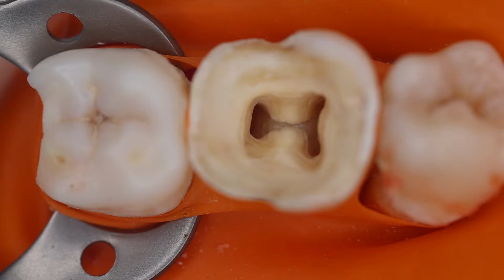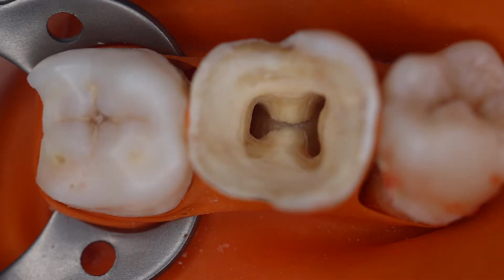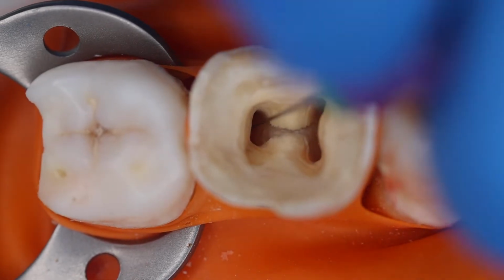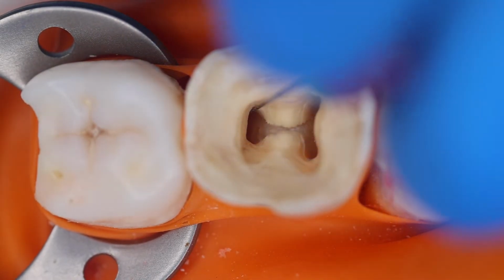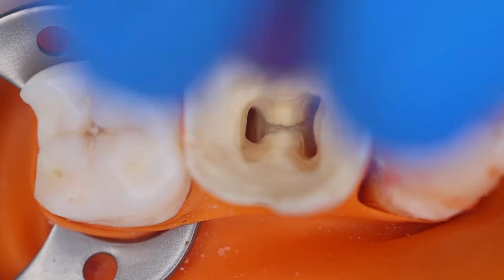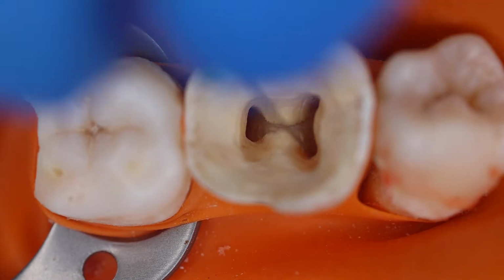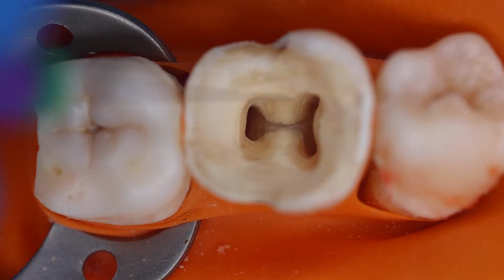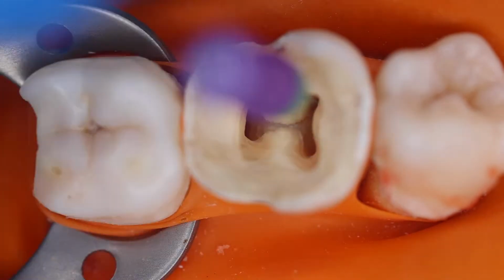In this video we are going to demonstrate how to use the electronic apex locator to determine the working length. Once we have identified the canal orifices, we have negotiated these canals. We have not yet determined the working length, but we could negotiate the canals. The file is freely inside the distal canal. This is a single large distal canal. Then going into the mesobuccal canal. Then going into the mesolingual canal.